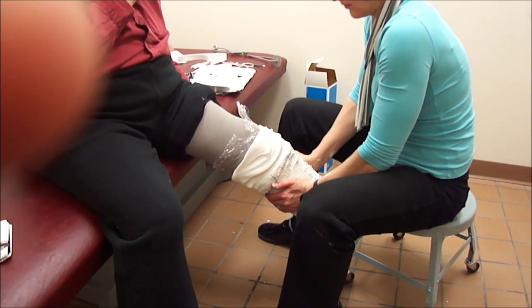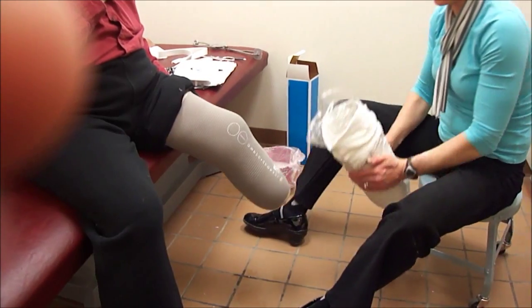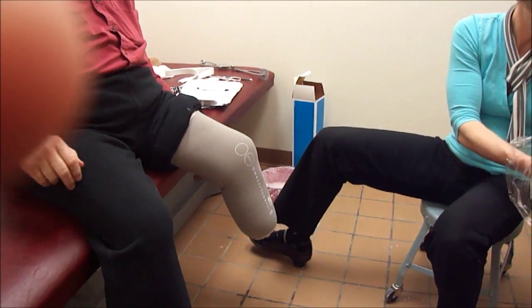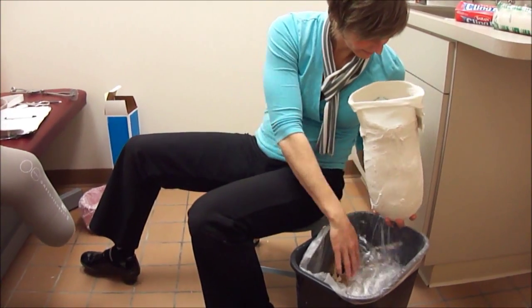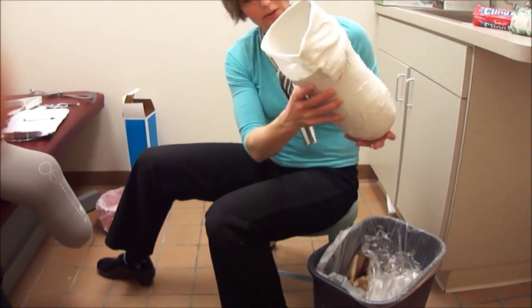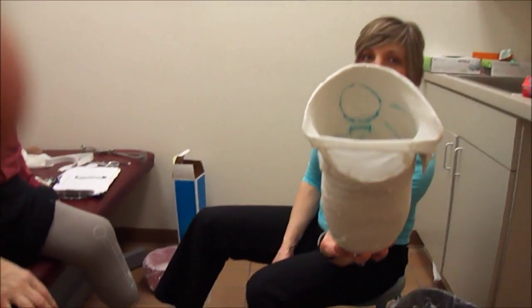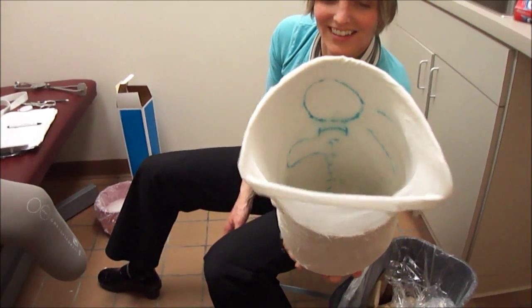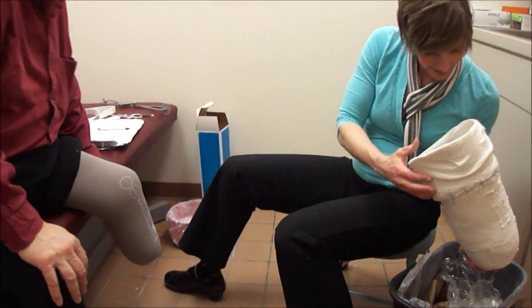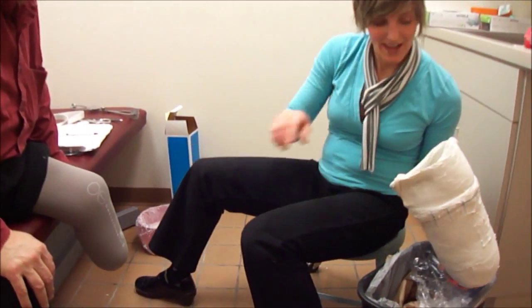Sort of stuck on my calf. Yeah, you can hear the air kind of moving out of there. There you go. So, those were the marks that I made on the inside of your leg. Let me take a picture of that. Yeah, that's cool. I got it. Good. And I think it's got all the little ridges there from the actual liner.